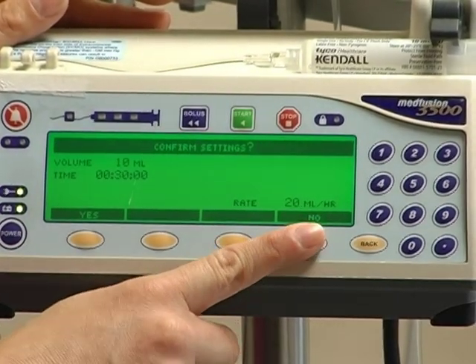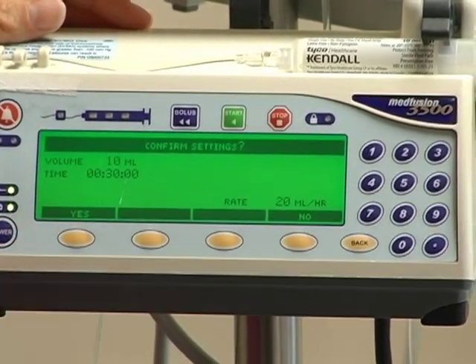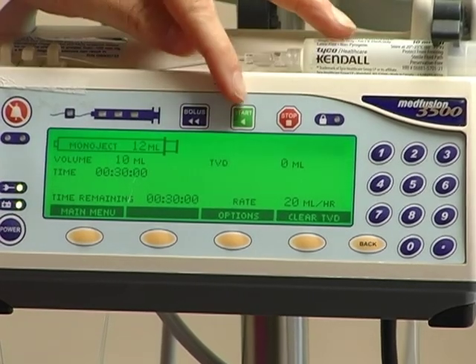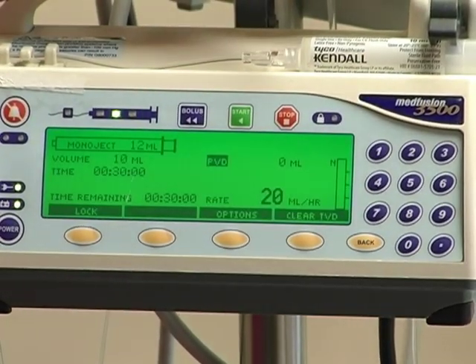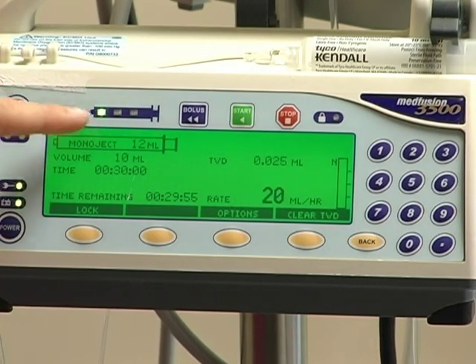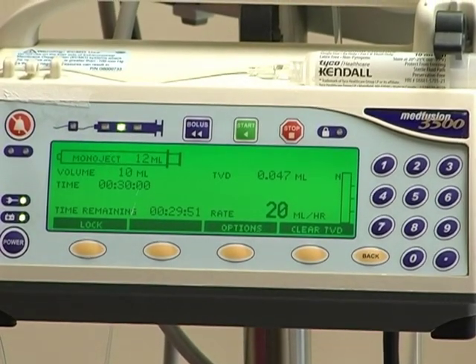If it's not correct, clicking no will take you back to the screen so that you can make any appropriate changes. So again just click yes. Then the last thing you will have to do is hit the start key to start your infusion. Once your infusion is running, you will see the yellow buttons here on the syringe, and that tells you that your medication is running.